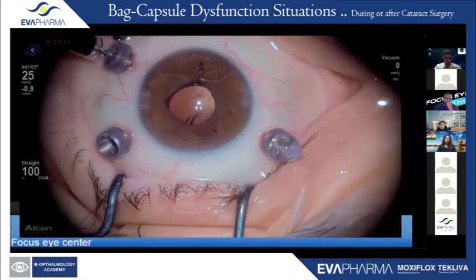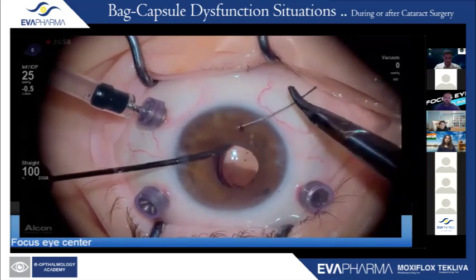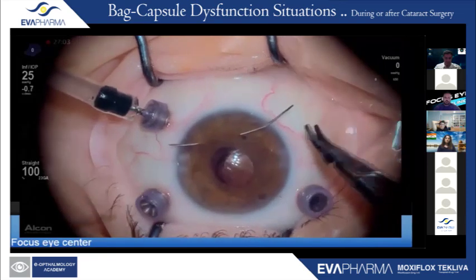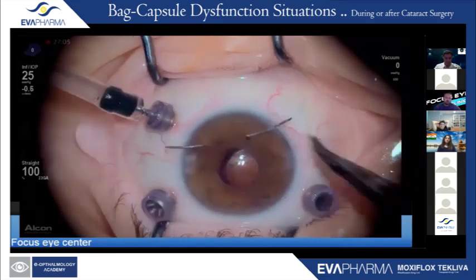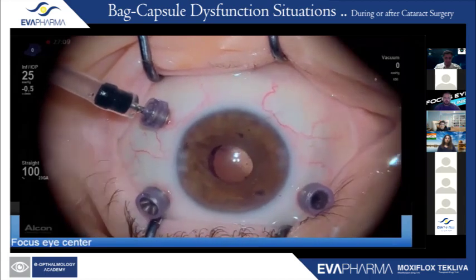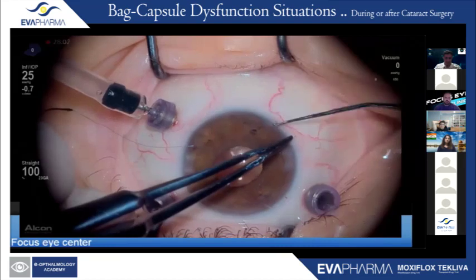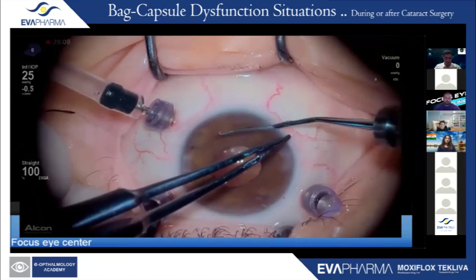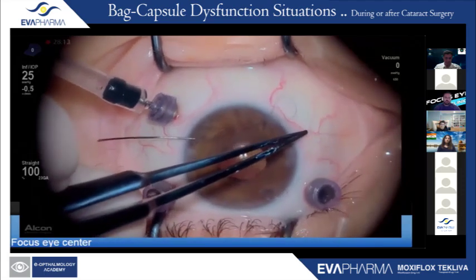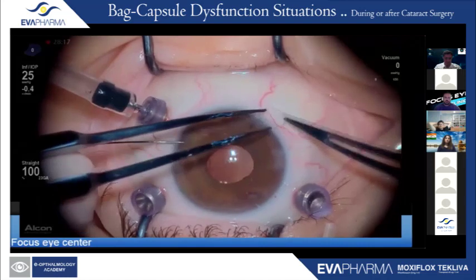And one advice, don't tie too much before centering the upper haptic, because often you can have a cat pupil. So if the sutures are not tight before readjusting the pupil shape with the micrograsper, you can relieve small amounts from the iris which were kept with the bite with the needle.